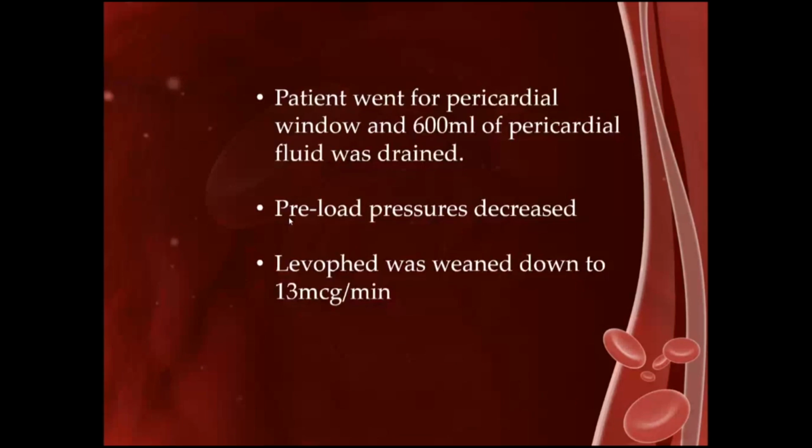And this just goes to show two things. The fact that the device that we use is invasive doesn't necessarily mean it's more accurate than a non-invasive product. And the other thing that I want to point out is you can see here the difference between using pressure versus flow to determine if this patient is actually fluid responsive.